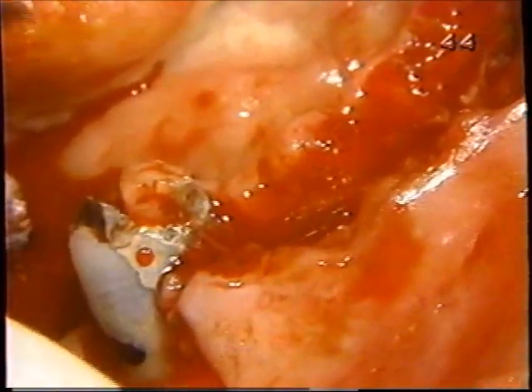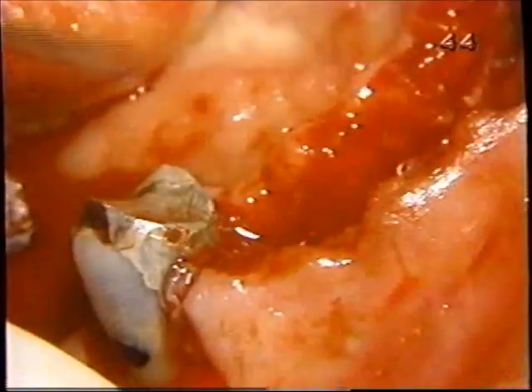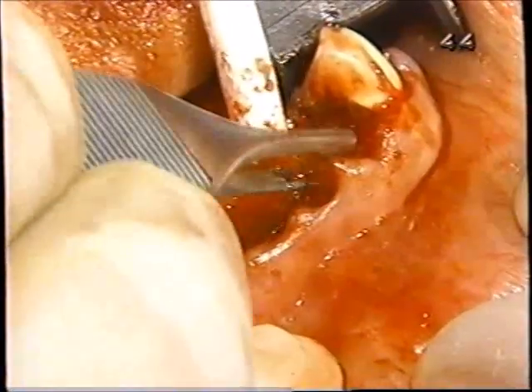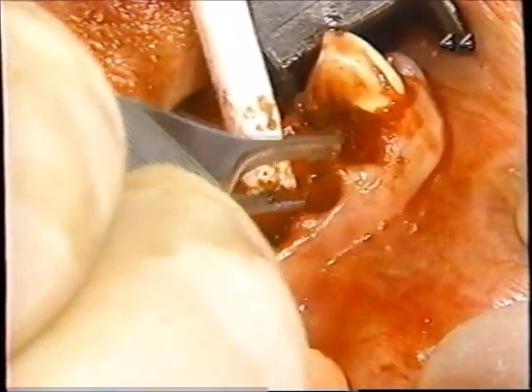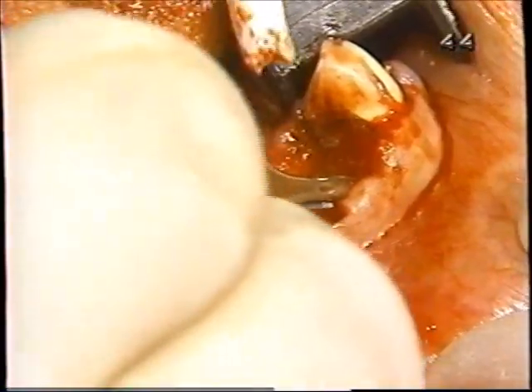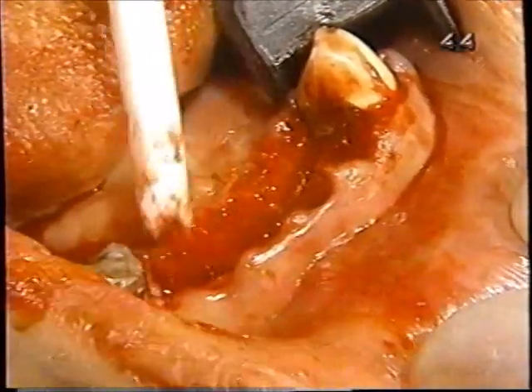Suction. Okay, section of it. Okay, that's all right. Okay, suction.